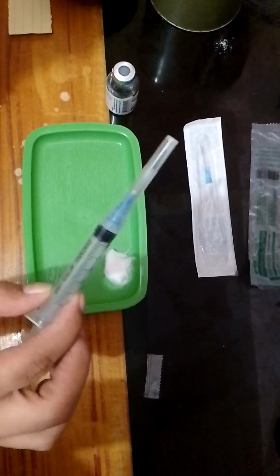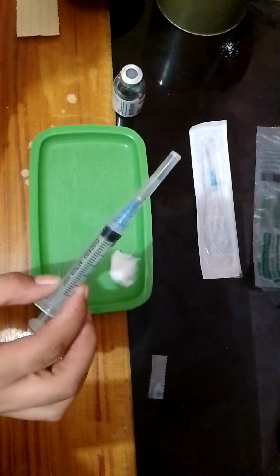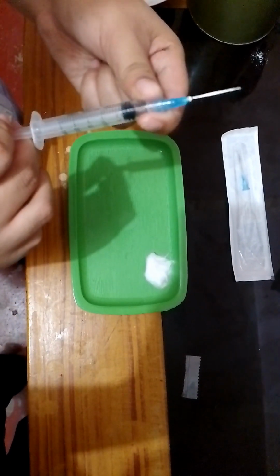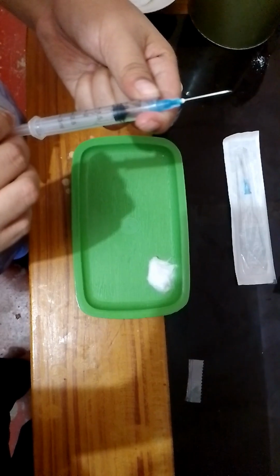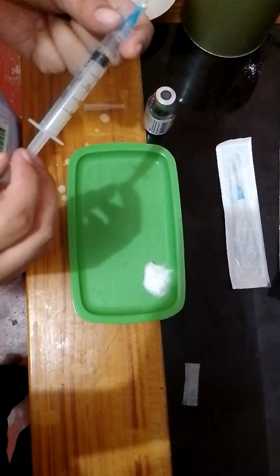And now take the syringe and then uncap, then draw air with the amount of the medication needed as specified by the doctor. And then after that, inject the air into the vial.